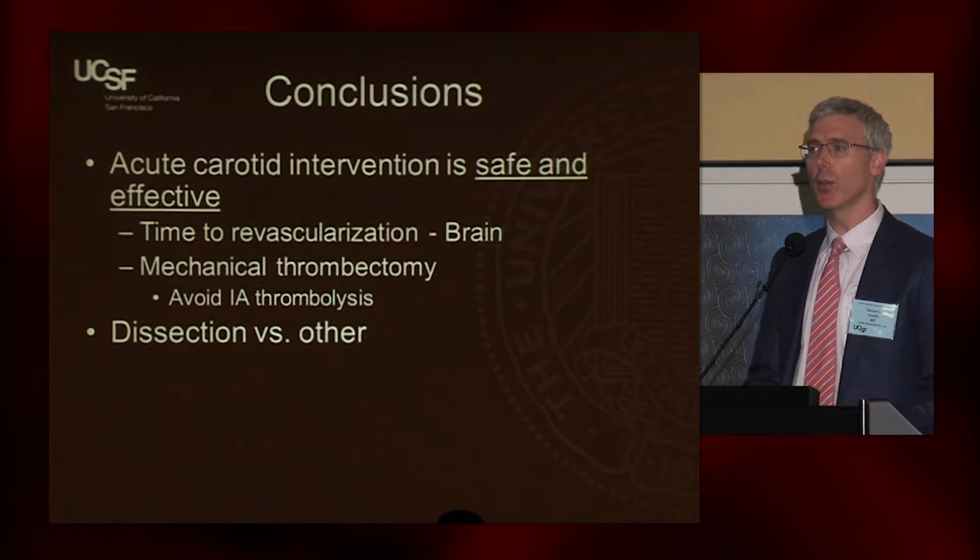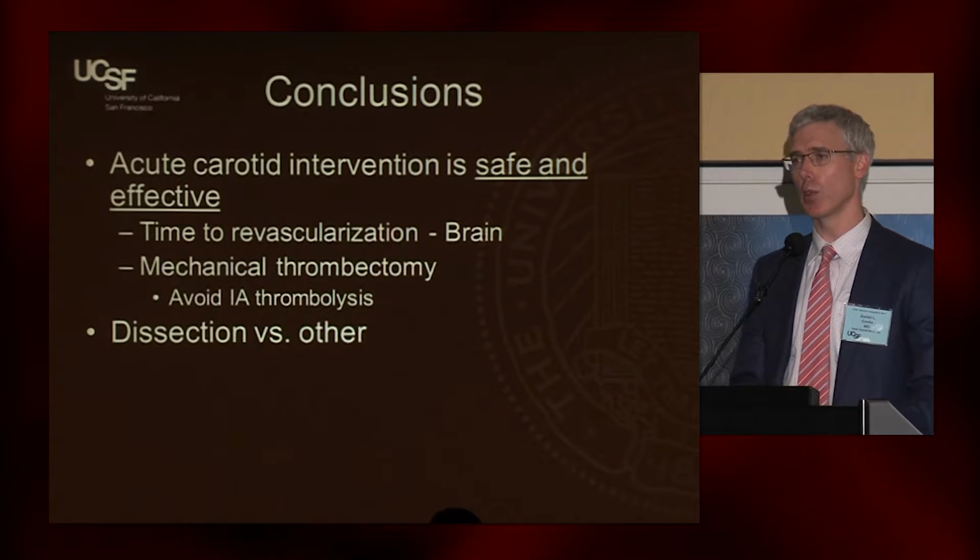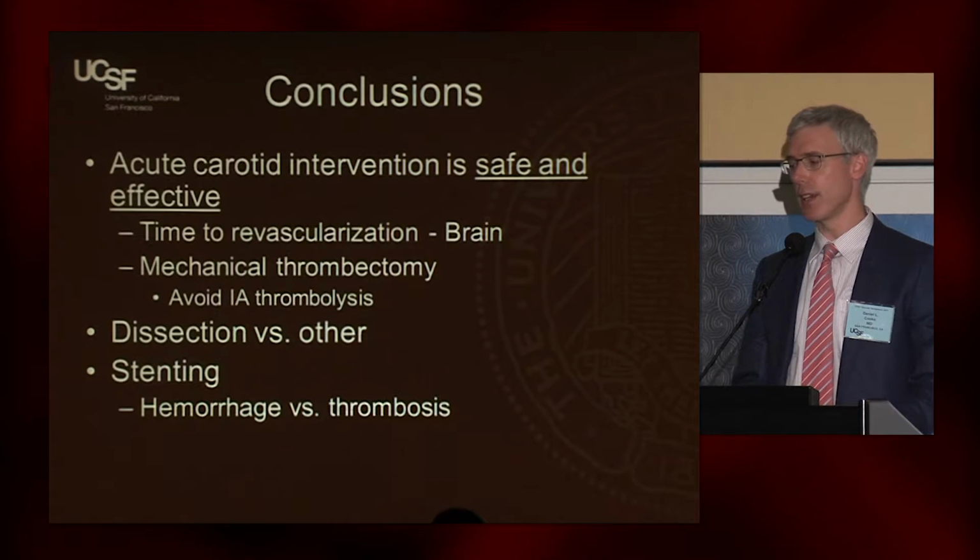I think it's important to recognize what the etiology is. So you want to really look at your patient population, but also look at the images. You want to know if it's a dissection versus some other cause. And then last but not least is the issue of stenting.